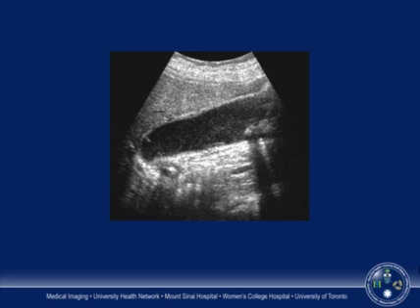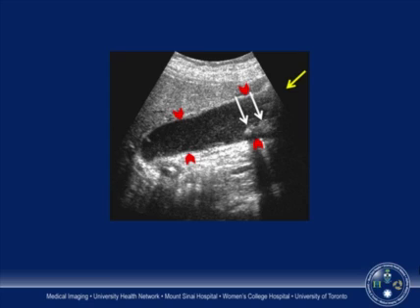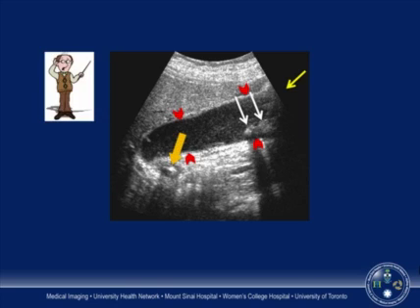Here's an example of a middle-aged woman from the emergency department with acute right upper quadrant pain. We identify gallstones, slide the probe down, and the patient is maximally tender over the sonographically localized gallbladder. Note that the gallbladder is tensely distended, though the wall is not particularly thickened. Another teaching pearl: pay particular attention to the region of the gallbladder neck and cystic duct looking for the obstructing stone, as finding it adds confidence to your diagnosis of acute cholecystitis.